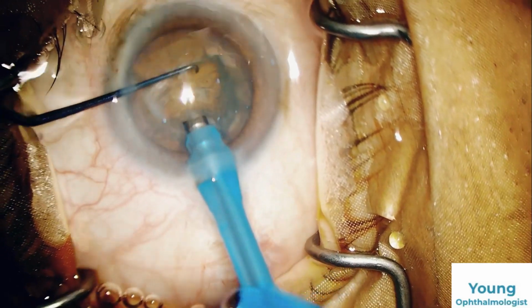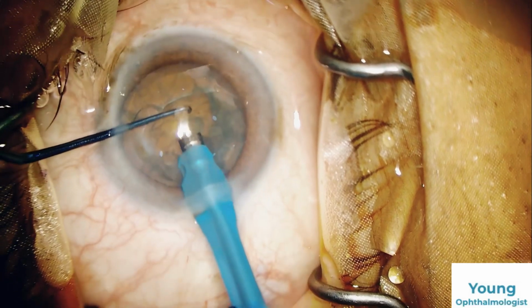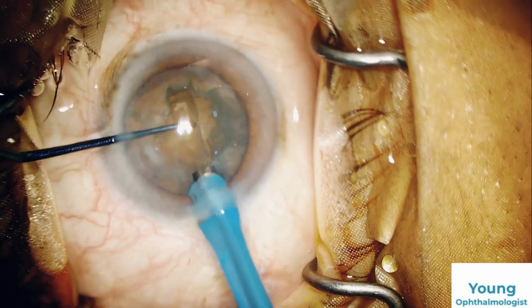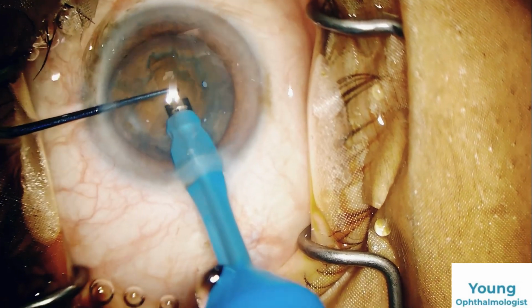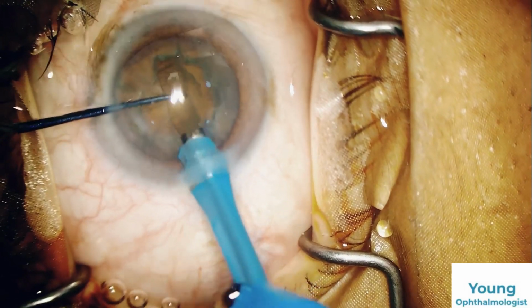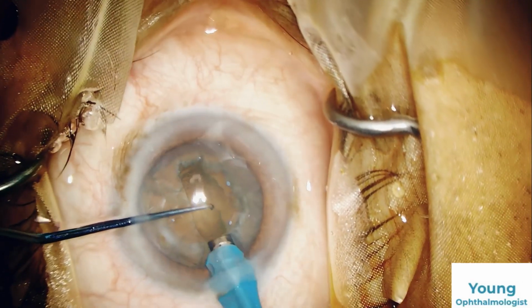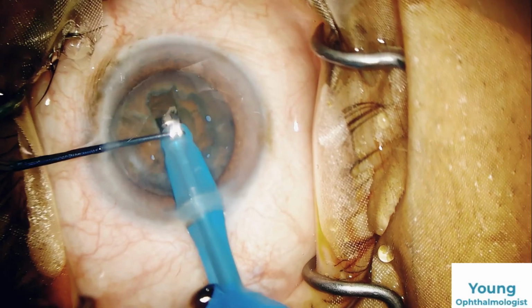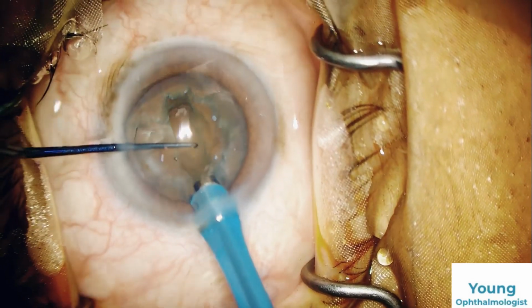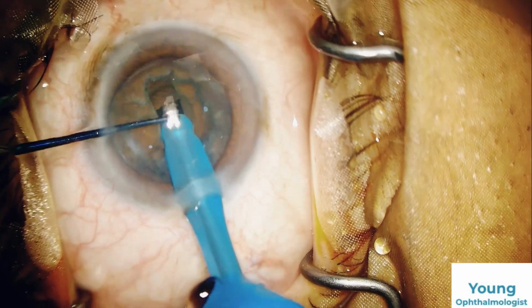Removing some epinucleus. Now making a trench, 1.5 width of the phaco tip and trying to go at least 80 to 90% of the depth of the nucleus. Here, while applying the phaco power, you should take care that it should be sufficient and there should be no pushing mechanism while making the trench.